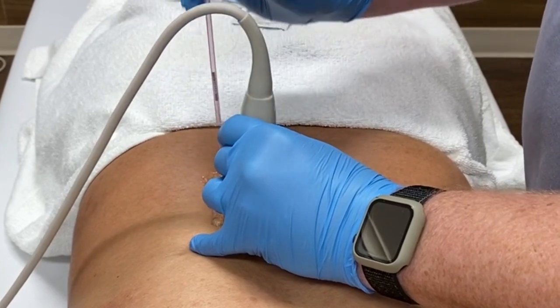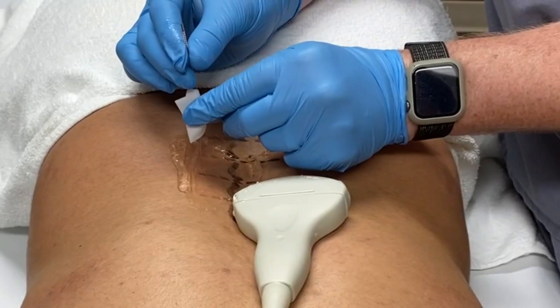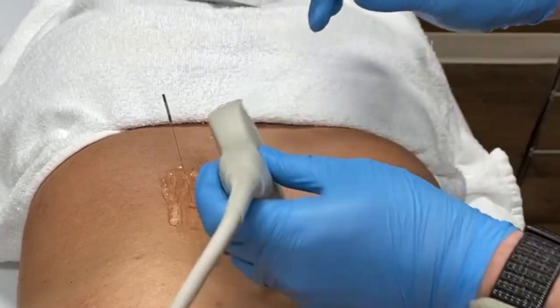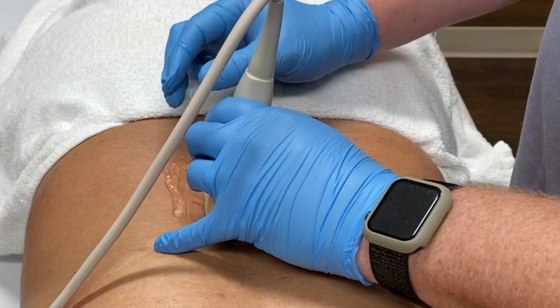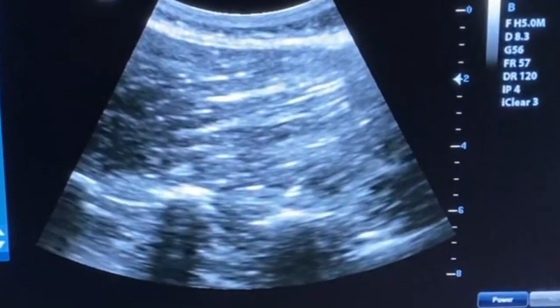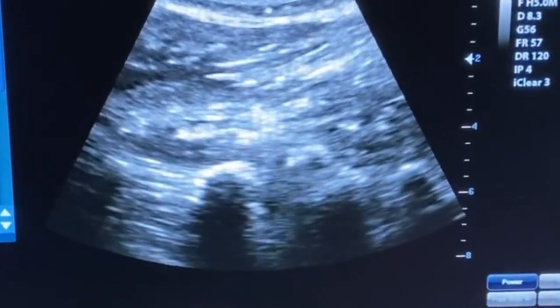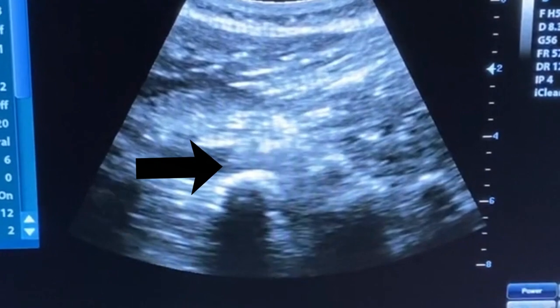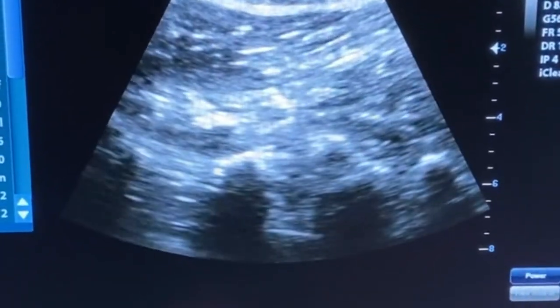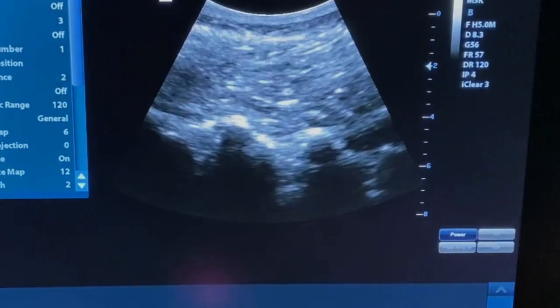I found the image I wanted and I'm taking this 100 millimeter needle and tapping it into the tissue. Here's a prime example of a long needle that's difficult to get in — so I pause, take an alcohol wipe, and use it to grab the needle to get it inserted a little better because it's longer and harder to manage. Then I reacquire my image. This is an out-of-plane needle technique — I take the needle in on the side of the ultrasound transducer as opposed to being in line with it. On the ultrasound screen you can see those three little knuckle-shaped mountains — the transverse processes. I hit the edge of the transverse process, hitting bone, so I had to pull back and redirect caudally to slide in between the transverse process segments.